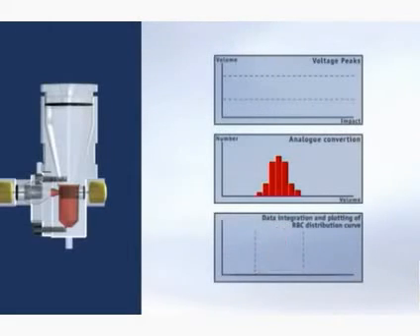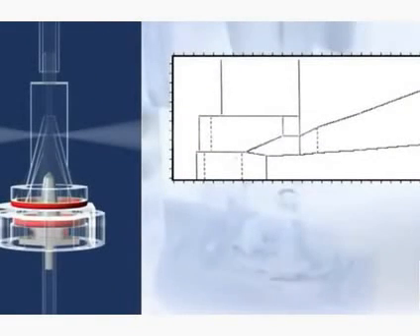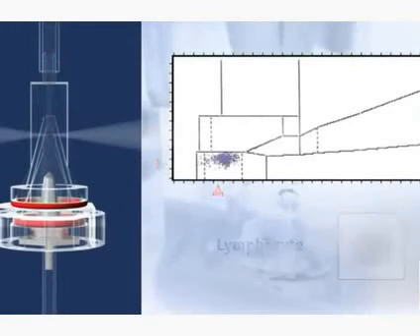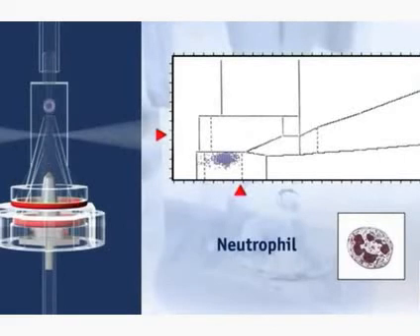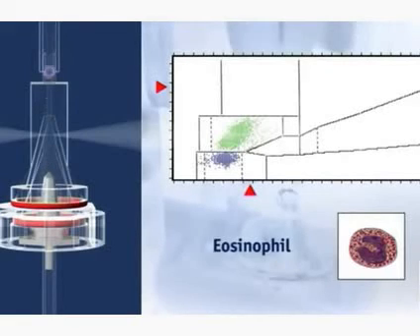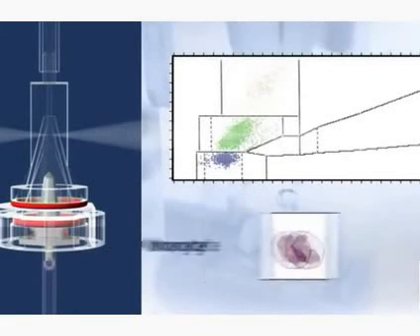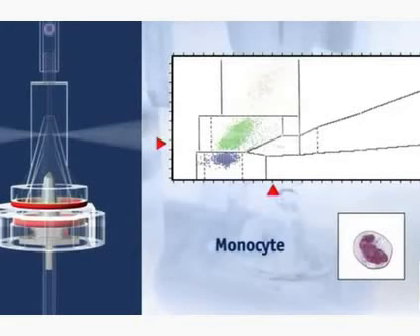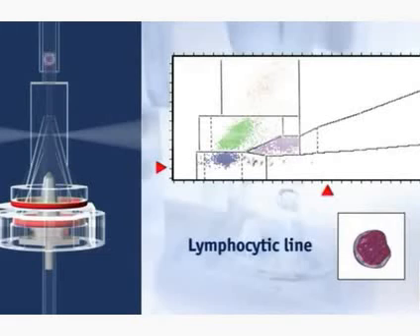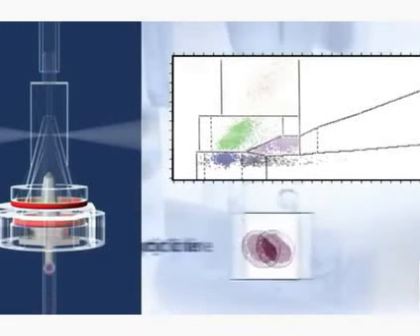This is the RBC count in detail, showing how to find out the health condition of the RBC, whether the cell is affected with some disease or whether the cell is good, and how many dead cells are there. We can do everything with this analysis, and leukemia cells can also be detected.